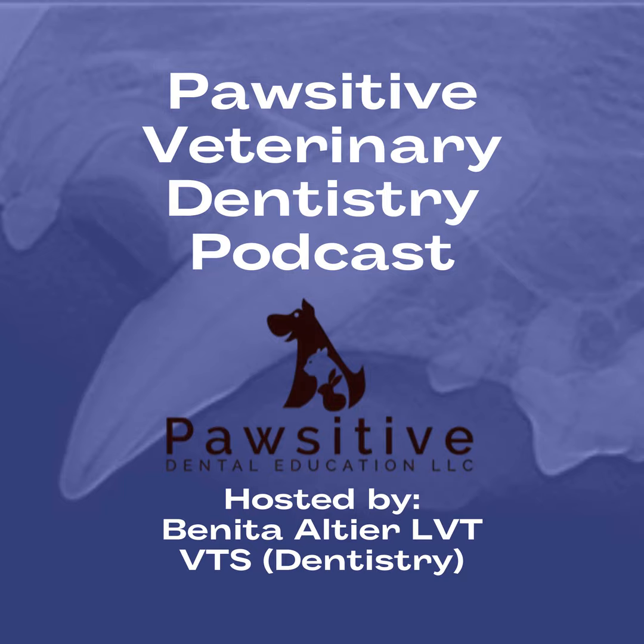Right. So I think positioning and contrast, and then having a grasp or a knowledge of what it should look like to begin with, I think that's really valuable. I often think of the most common disease that we see in our dentistry patients, periodontal disease, as being the most important thing that we're really looking at when we look at the dental radiograph.